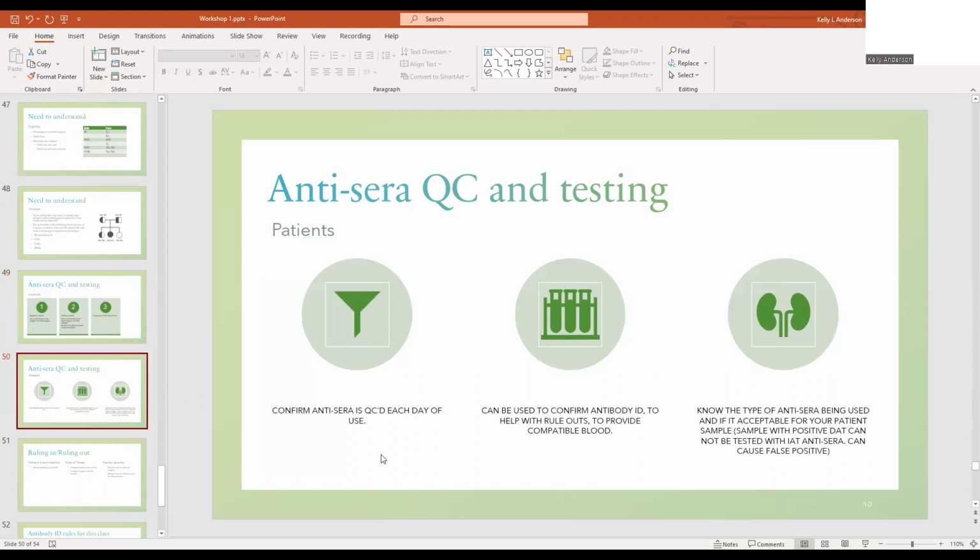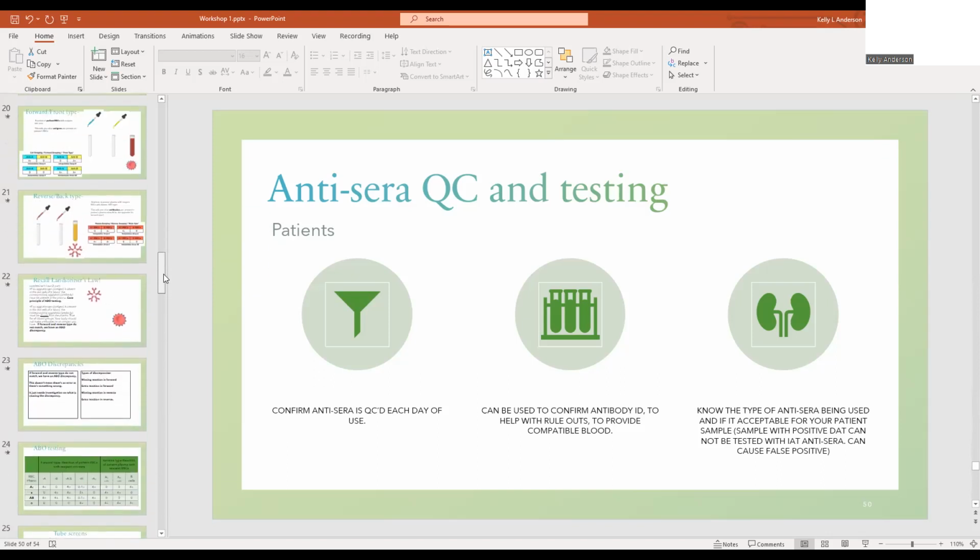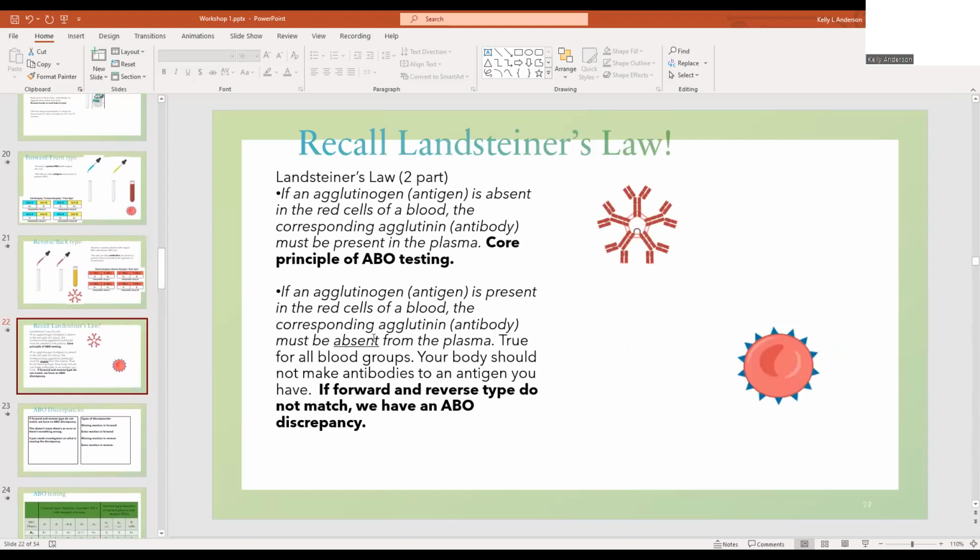So before you do a patient, you want to check and make sure that it is QC'd, or QC it with your patient. And why do we want to type our patient to see if they're positive or negative for an antigen? Anytime you do an antibody ID, you want to confirm that that patient is negative for that antigen, because if we go back to Landsteiner's law, if an antigen is present, the antibody must be absent from the plasma.